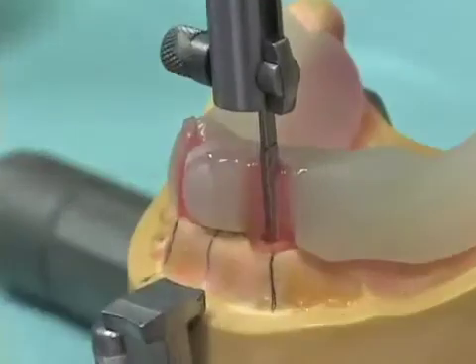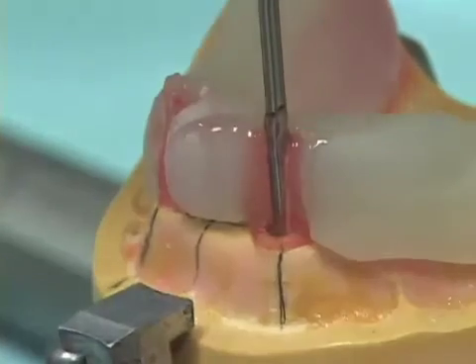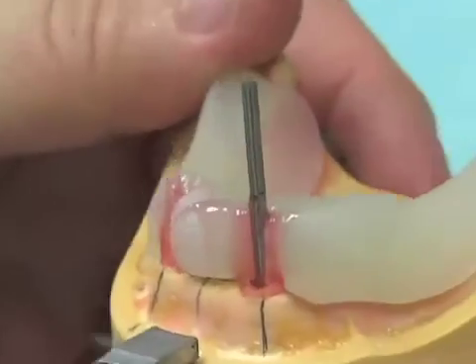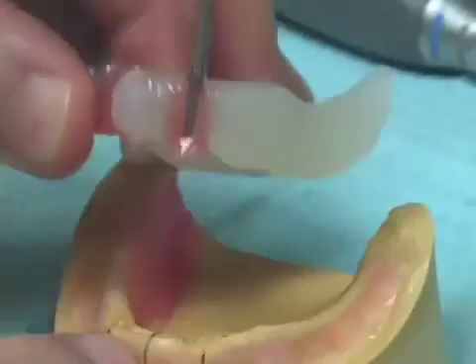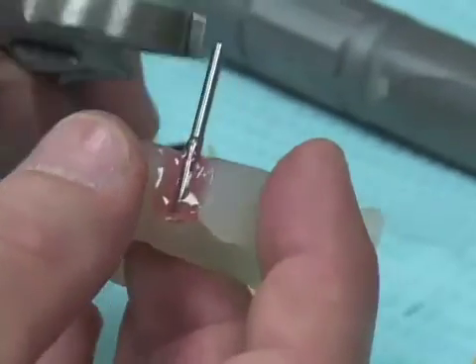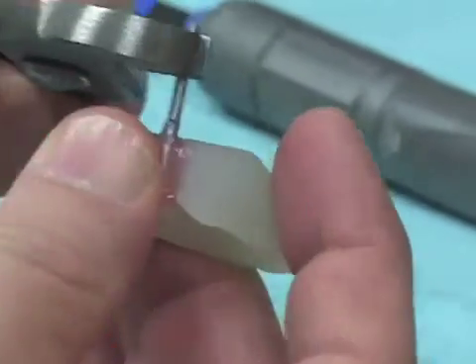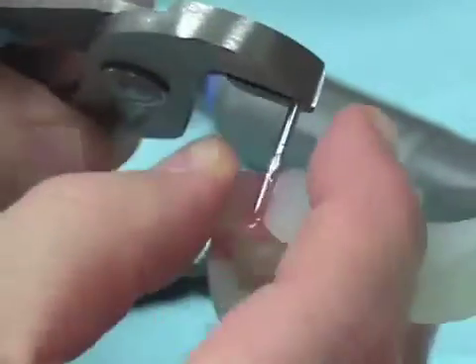And we've now completed curing the triad gel around our drill blank. We simply lift the vertical spindle of our surveyor up. I'm removing the cast. So now what I'll do is again just first rotate the drill blank and then lift up vertically.